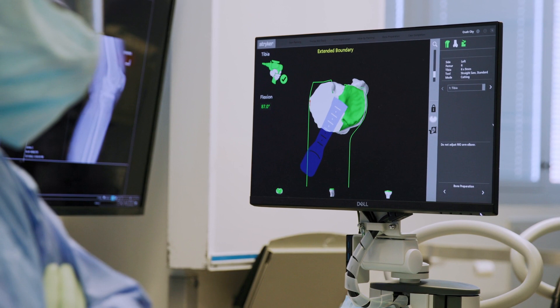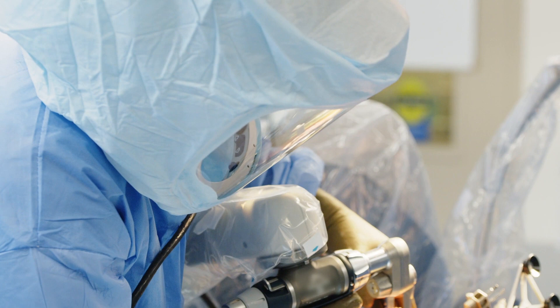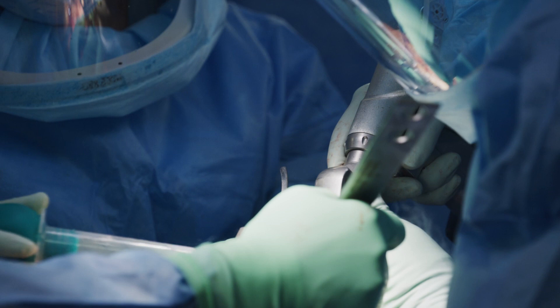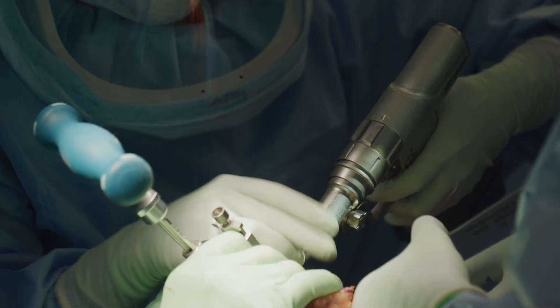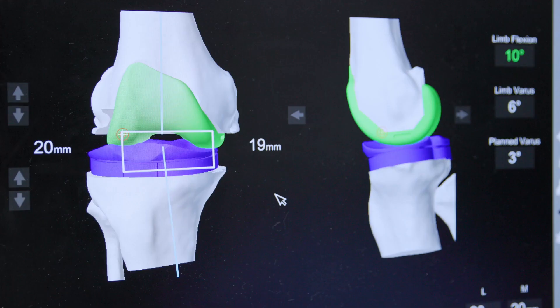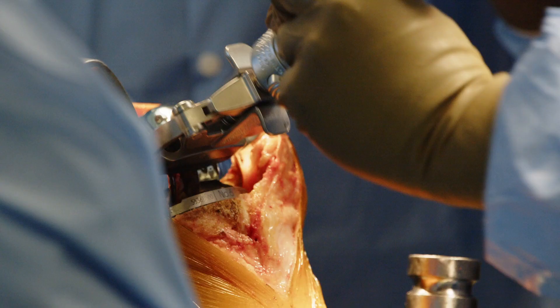With robotics, it does give you a lot of feedback, and it actually has some safety mechanisms built in. There are a lot of important structures in the knee that we don't want to cut, specifically in the back of the knee. The robot will actually stop you from passing the saw too far back into those danger zones. It's also good for certain patients that have some unique conditions. With a manual total knee replacement, oftentimes we have to place rods up and down the bones — sometimes that's not possible if someone has prior hardware, like a plate or screws, that prevents us from accessing the femoral canal or the tibial canal. We can actually bypass that whole step with robotics. By taking some measurements and adjusting some of the settings of the robot, I'm able to place that implant wherever I want on the bone, ultimately making a much more well-balanced knee that's more precise to the individual patient.